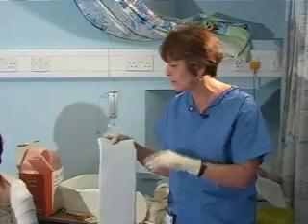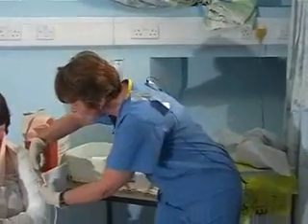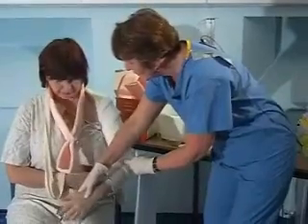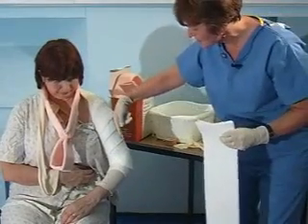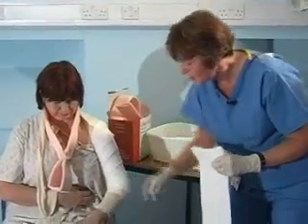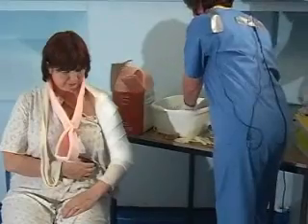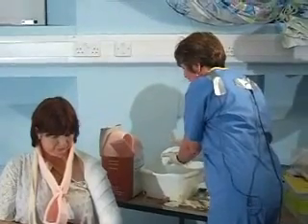Also with her arm I don't want to pull it too forward because I may angulate it. I need to take her arm and sit up straight, put the hand on the lap, because I need to get the arm in right alignment — otherwise the fracture is unstable. So I'm going to position it on the lap now. I've got the 8 layers which I'm going to dip in the water and take out. I'm not wringing the plaster because that will take away a lot of the thickness — just draining it off. You'll see in the plaster bowl how much plaster has been wasted in the bottom.